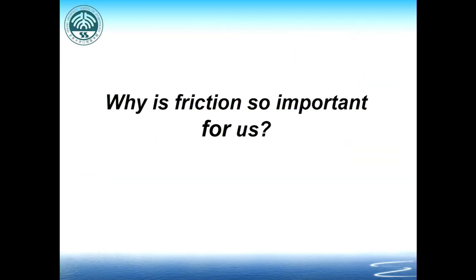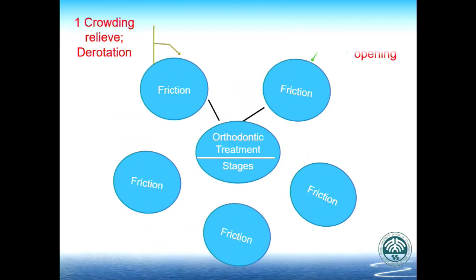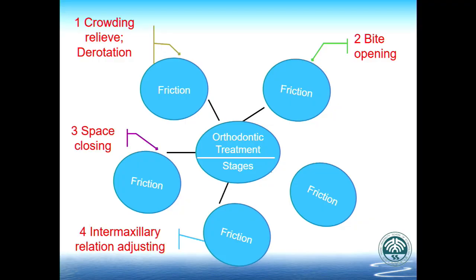So why is friction so important for orthodontists? Because in every stage of orthodontic treatment, friction exists, and the friction matters. That's why. And if we change the frictional force, it may affect the efficiency or the outcome and even the treatment experience of orthodontic therapy.